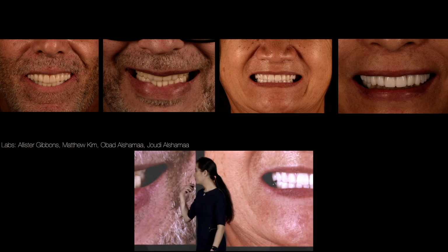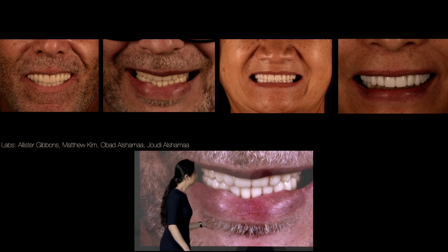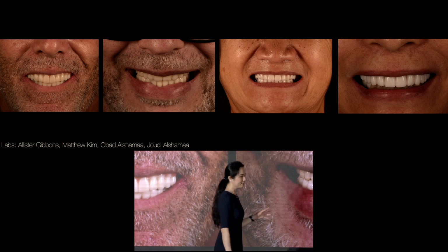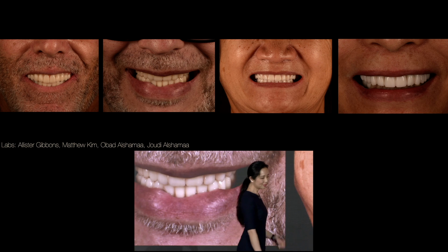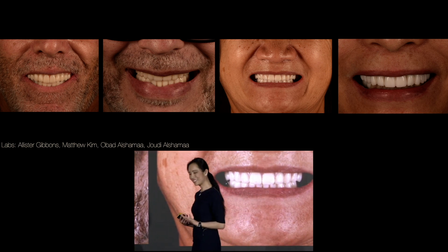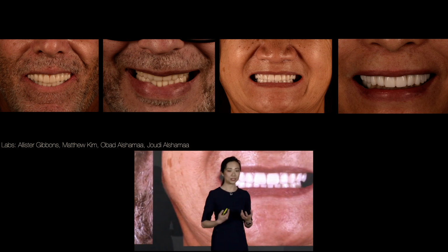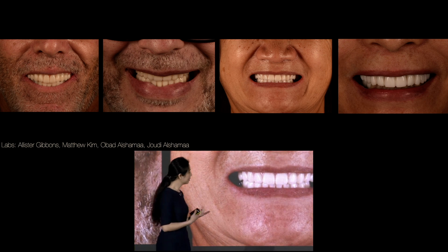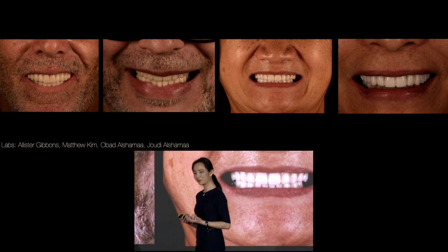So these are just a few examples from local labs, and what you'll find is that when you have a dialed-in, completely digital workflow, you can work with anyone and be able to get pretty good results. Because what happens is that when everyone's using the same design software and you have the ability to evaluate the work ahead of time or make minor adjustments along the way, the adjustment times are much faster. And also, all the labs are able to do better work.